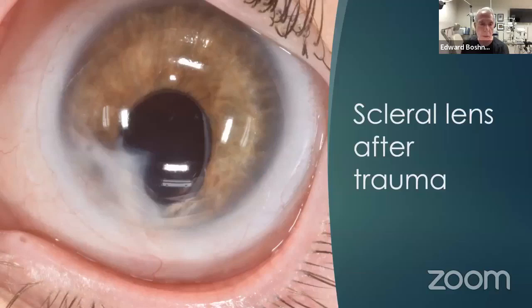So this is an eye of a 5-year-old girl who was working out on an exercise machine while her mother was doing something else. She wasn't being monitored properly, and something snapped and perforated the cornea. She had a retinal detachment, she had a vitrectomy. Her own lens in her eye had to be removed. So this is an aphakic eye, and we fit this eye with a scleral lens. And so this is where trauma comes into effect, where a scleral lens can really help out a patient.